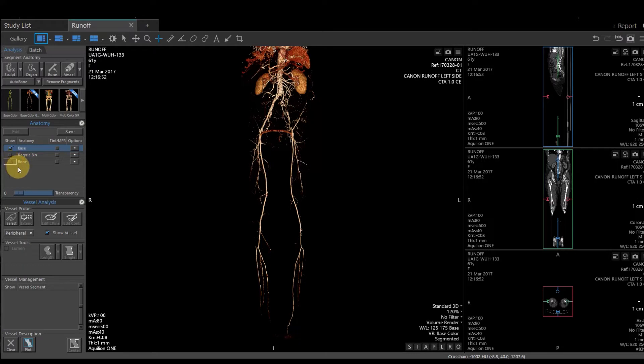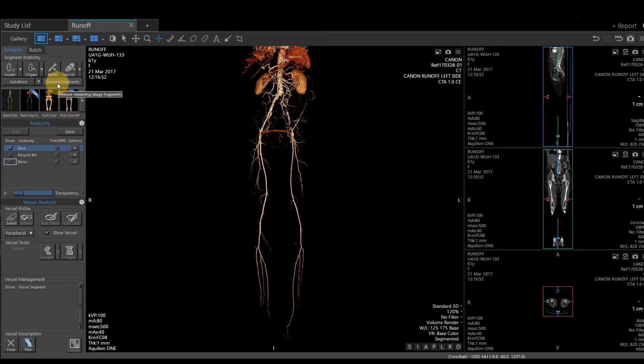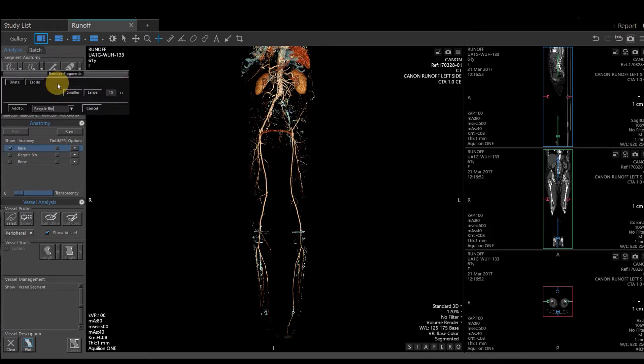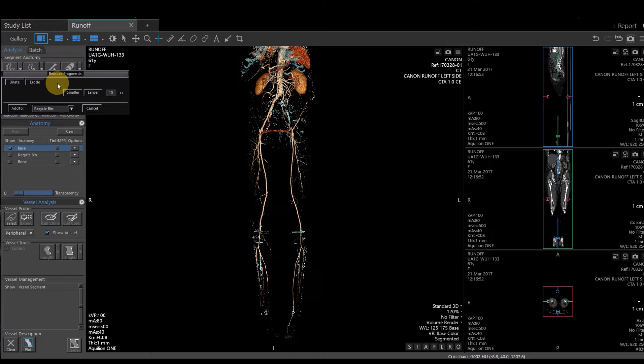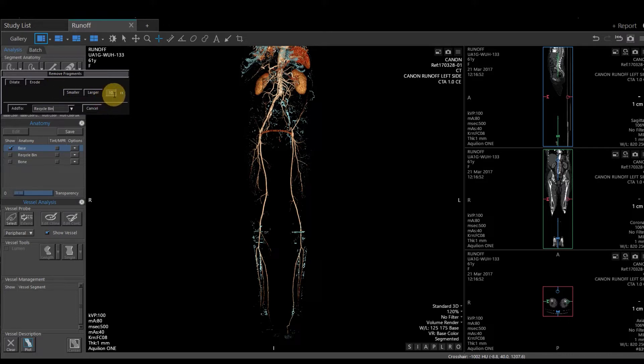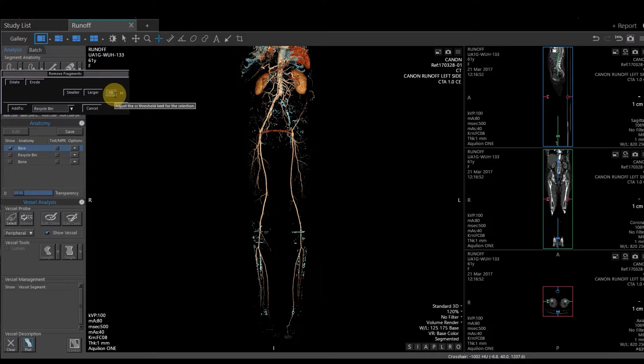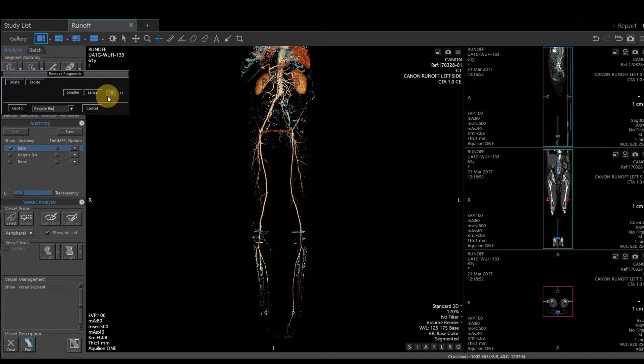The next thing I want to do is clean this up a little bit more. Sometimes there's a lot of little fragments, little pieces that get left behind. So to get rid of that, there is a button directly next to auto bone labeled Remove Fragments. You can select Remove Fragments. And if you look at the 3D image, we have a bunch of blue densities now that have been highlighted. Those are what Vitrea has considered a fragment. And to be considered a fragment by standard definition, it is something that is free floating and it has to be under 10 cubic centimeters to be defined as a fragment. You can change this number by hitting smaller or larger, and that will either increase or decrease the size of a considered fragment.